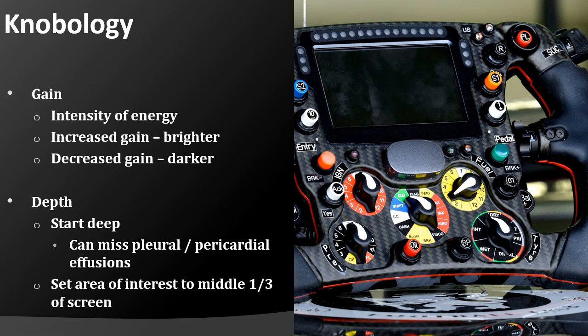Depth is also important. You want to make sure that you're starting at an adequate depth. Always start deeper than you think you need to ensure that you're not missing anything important, and then decrease your depth to center in on the object that you're trying to image. Typically, you want to set the area of interest somewhere around the middle to the upper third of the screen.